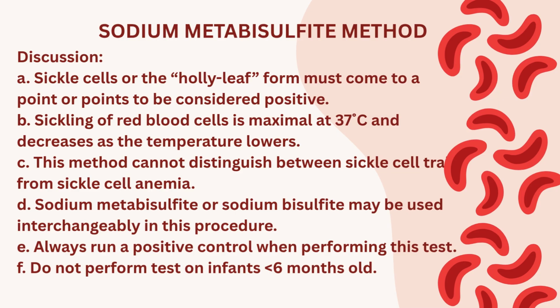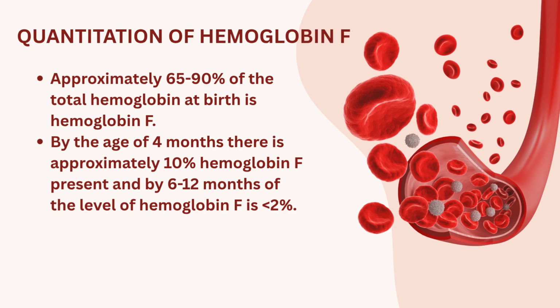Sodium metabisulfite or sodium bisulfite may be used interchangeably in this procedure. Always run a positive control when performing this test, and do not perform tests on infants less than 6 months old.